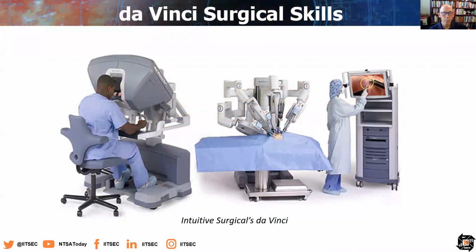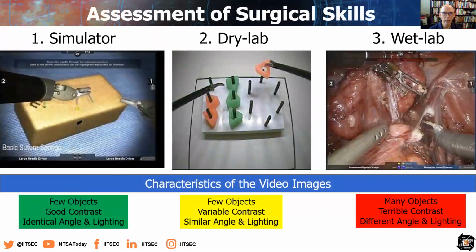surgeons. So at the Nicholson Center, we offer courses which teach practicing surgeons how to do robotic surgery for the first time. And they come to us to learn all the basic skills that they need to control the machine and to understand how to use all of the instruments. During that course, they go through a number of assessments.